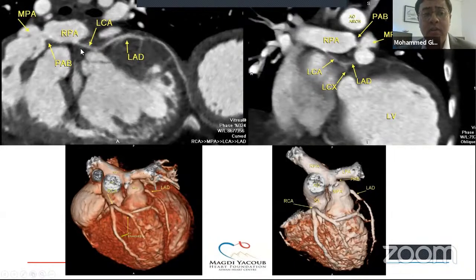Coronary artery from pulmonary artery, but not the usual ALCAPA. This ALCAPA originated from the mid right pulmonary artery above the level of the band. As you see here, this is the main pulmonary artery, this is the pulmonary valve leaflet. This is the site of the band, and this structure was the RPA giving supply to the left coronary artery.